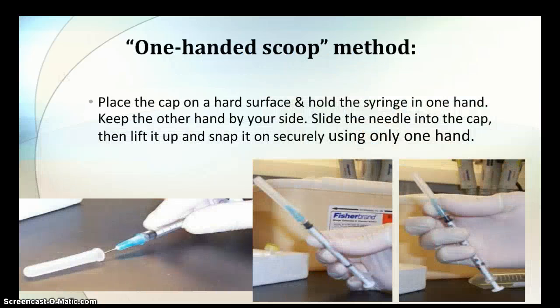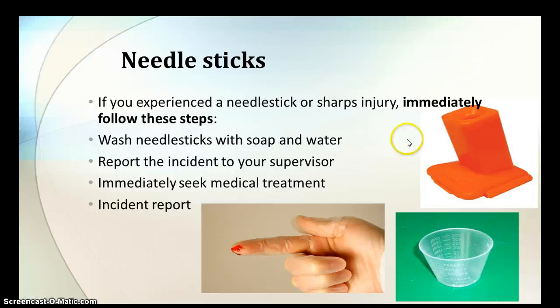And then as far as capping, if you do need to recap, say after you've loaded up or drawn up your medication, you use the one-handed scoop method. And here is one way to do it, and here's another way. You can actually put the cap here, and you can recap easily without contamination.